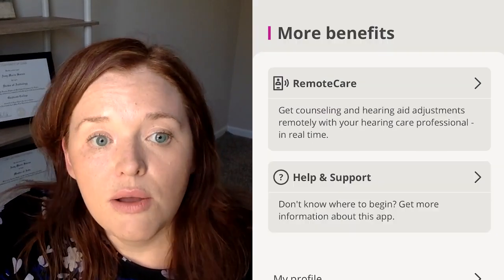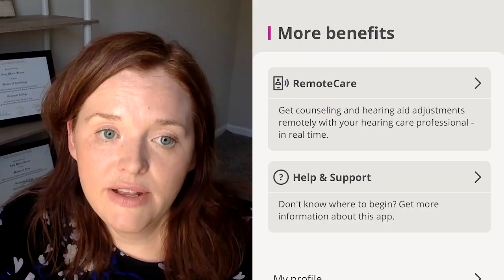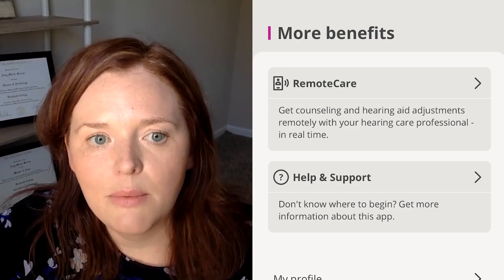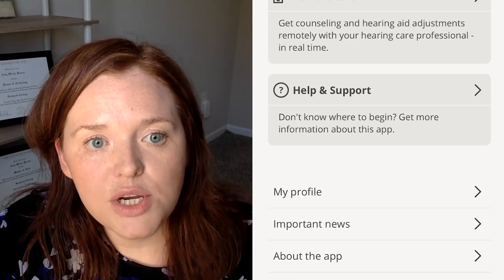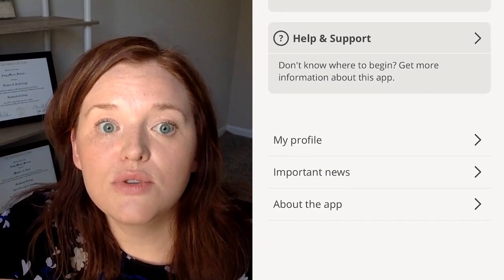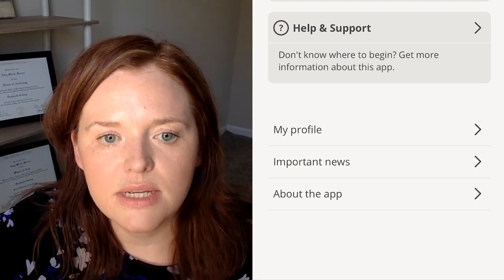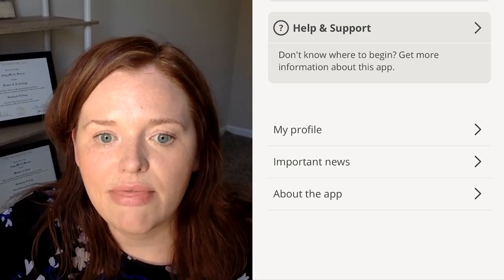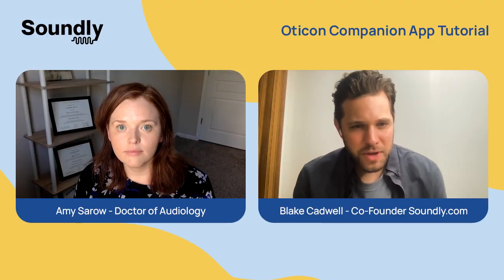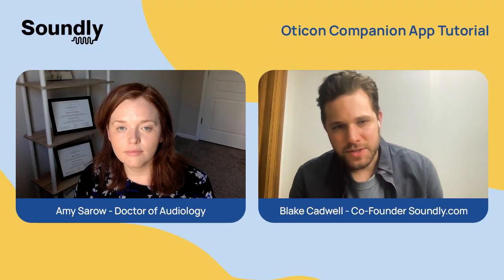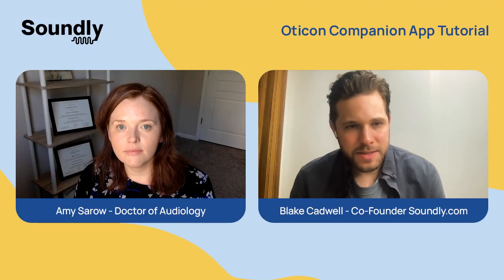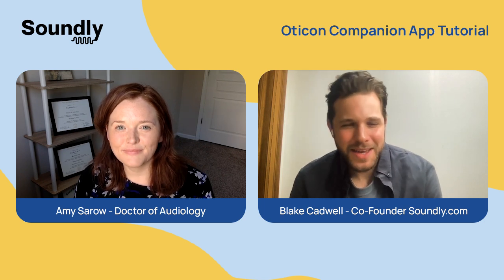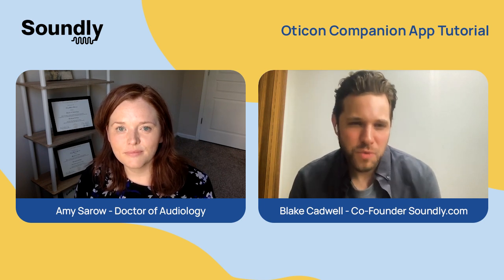And if you go under 'more benefits,' you'll see this is where you can get into remote care. So once you've established care with a local audiologist, you can use remote care services here. If you did schedule that, you would go ahead and create an account and set that up there. So there you have it — that's the Oticon Companion app in detail. We hope this has been helpful. Dr. Ramey, thank you for your time, and to you the viewer, we wish you the best.